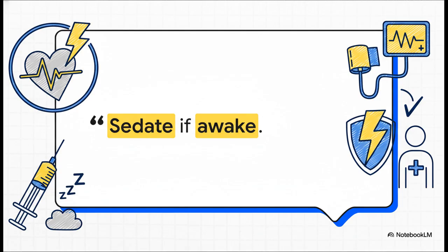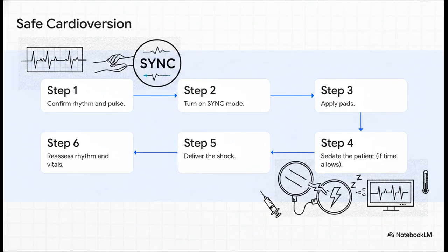If that patient is crashing, I mean their blood pressure is tanking fast, you do not delay a life-saving shock to wait for sedation meds to kick in. In that moment, it's life over comfort. So let's walk through the flow.